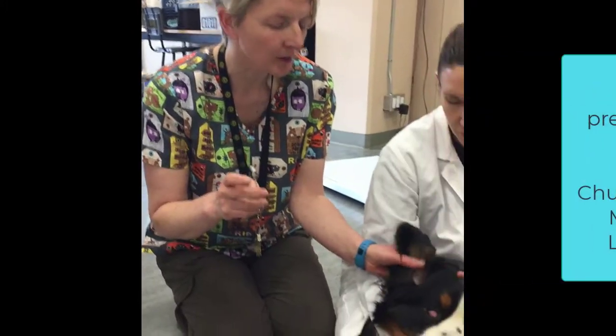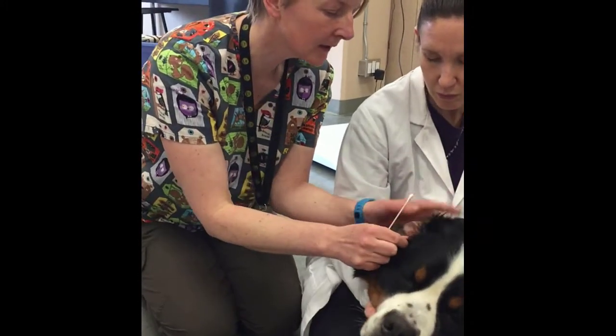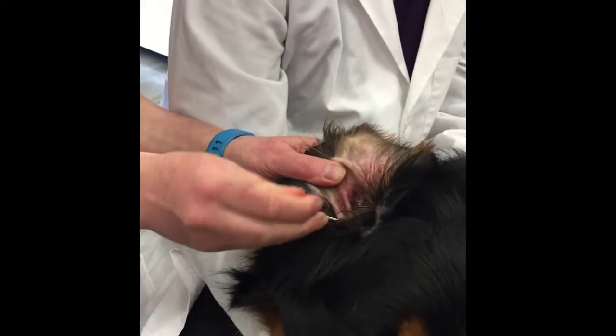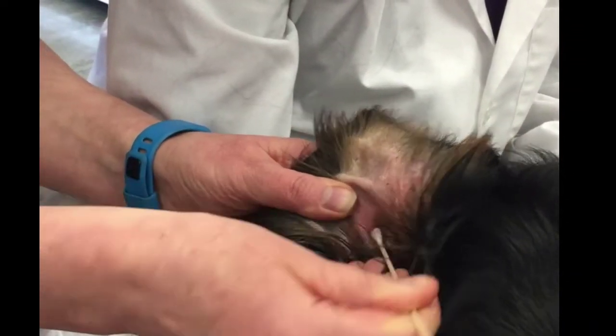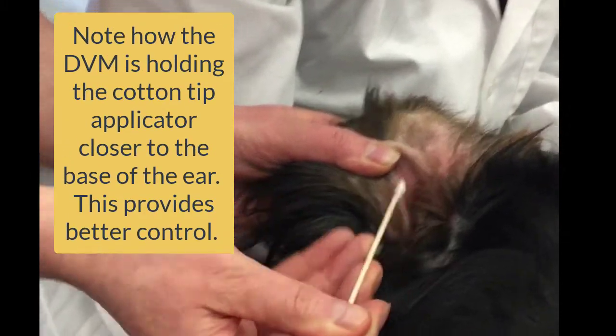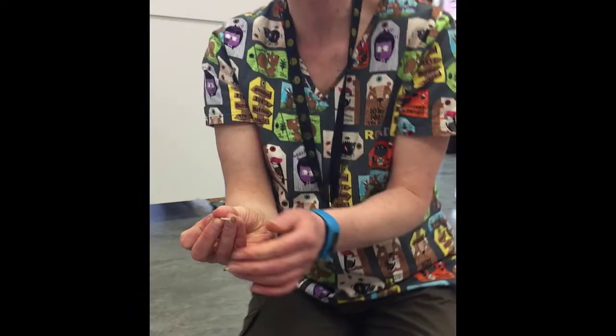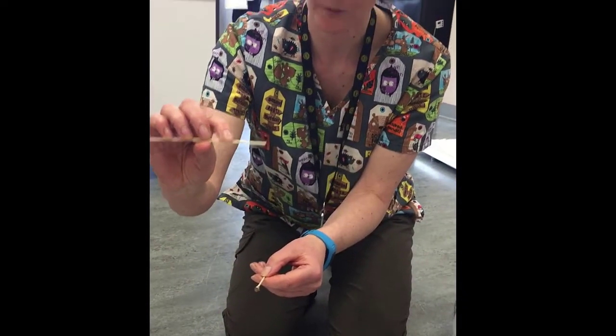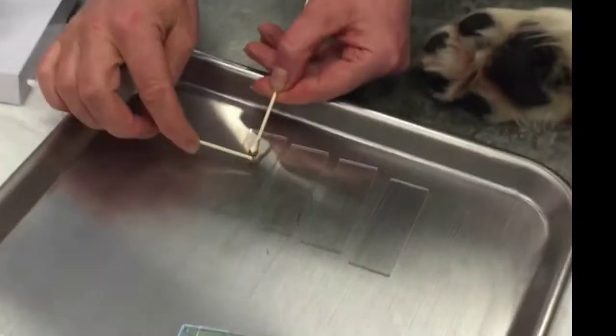So I'm going to get my swab, I'm going to get it into the ear, and I want to get some nice juicy chunks of wax, if I can. I want to get something. This dog doesn't have an awful lot of wax, but I want something hopefully a bit juicier than that. And then using the other end of another swab, I'm going to knock those chunks off onto my slide. I want a really good sample of wax.